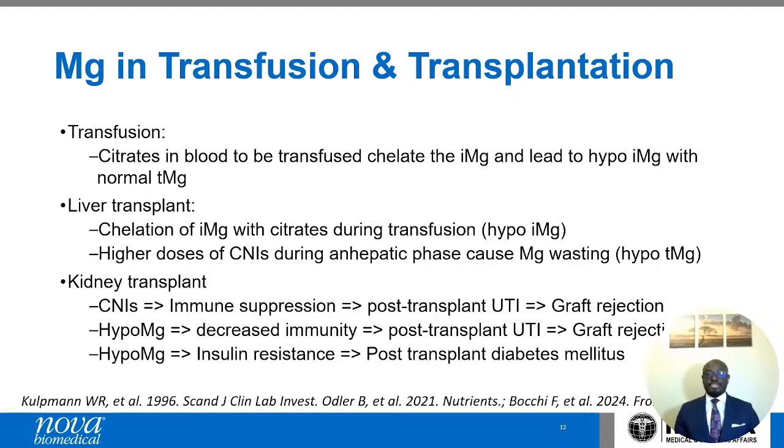Now, in these patients, if you test only for total magnesium, you see no difference in the magnesium levels before, during, and after the transfusion. But if you measure the ionized magnesium, you can see how the levels change, reducing after the transfusion and normalizing after time if the patient has a normal homeostasis to balance the transcellular movement of magnesium.